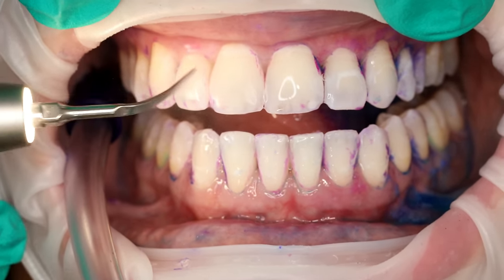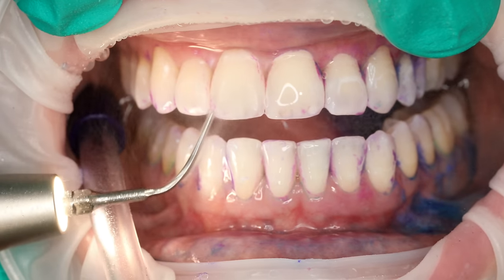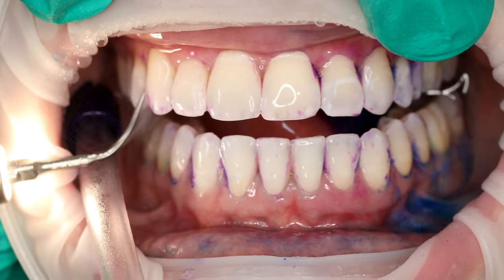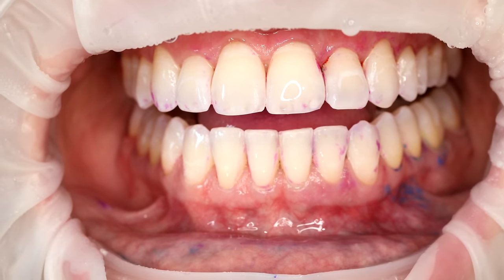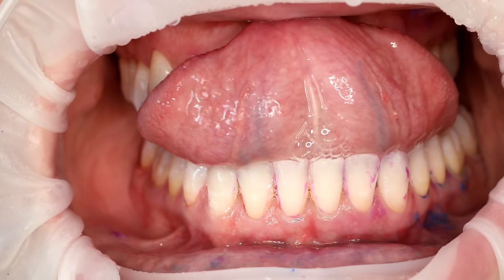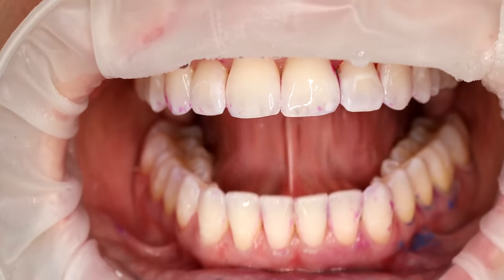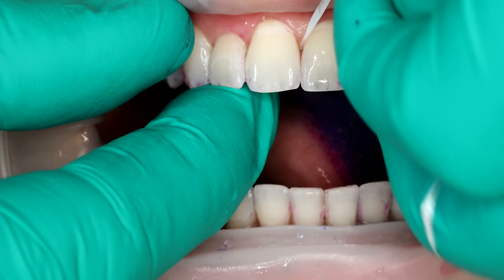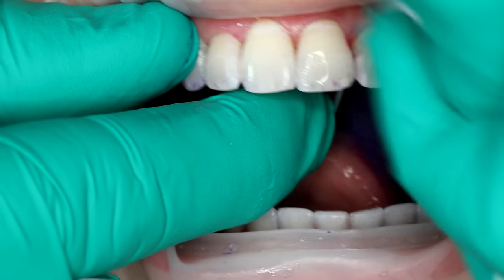As you've seen, we've gone through a couple stages here in cleaning these teeth. First, we started off with the disclosing agent. Second, we moved on to scalers. Third, polishing. And now we're still having to touch up using the ultrasonic. As you can see, after a couple steps, the teeth have cleaned up really nicely, but there are still a few spots that have been missed, even after doing a really good job. You finish off with flossing to make sure that nothing has been missed.